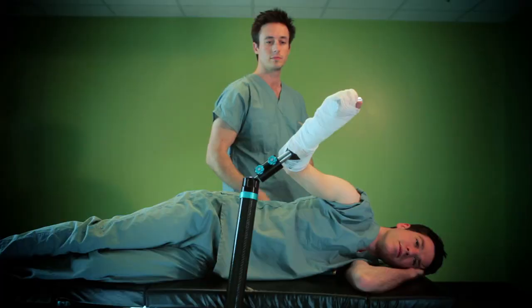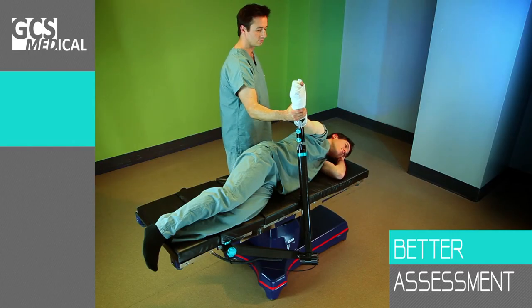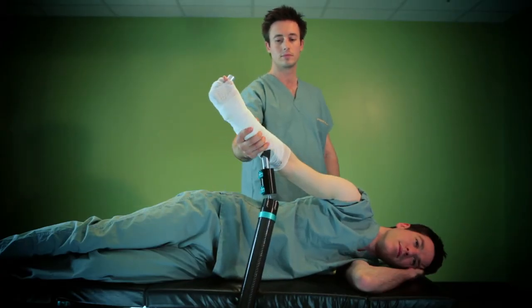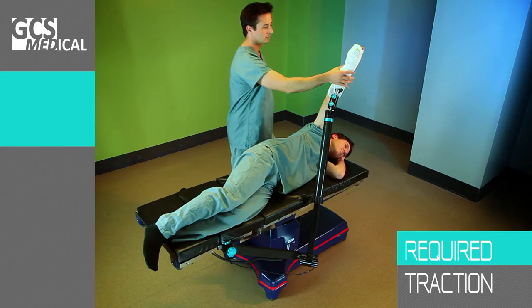With the Assist Arm, friction and suspended mass have been minimized to remove the device's influence on the user's perception. The ultralight Assist Arm allows the surgeon to move the limb using only one hand, and its light weight makes arm positioning much easier during lateral decubitus procedures.